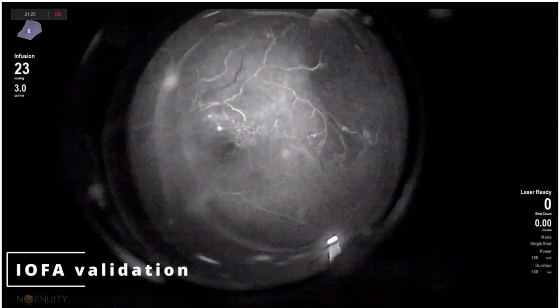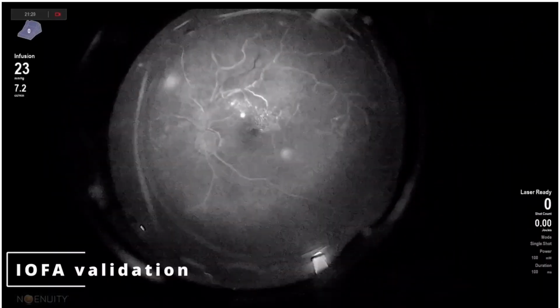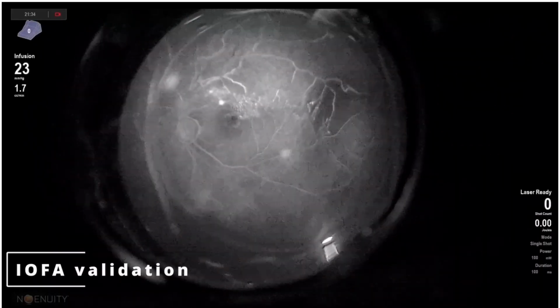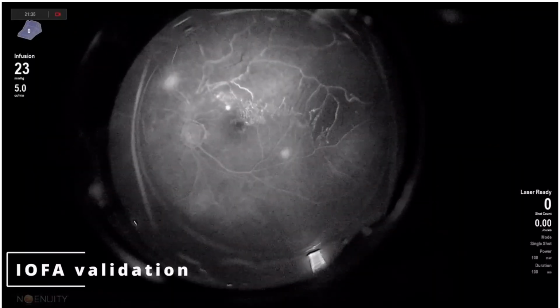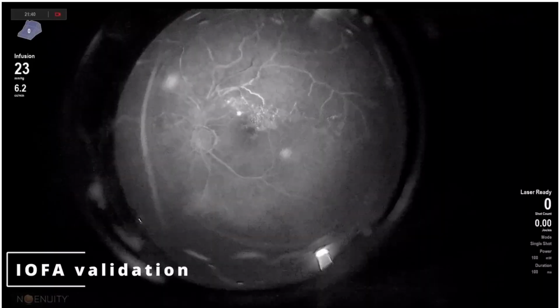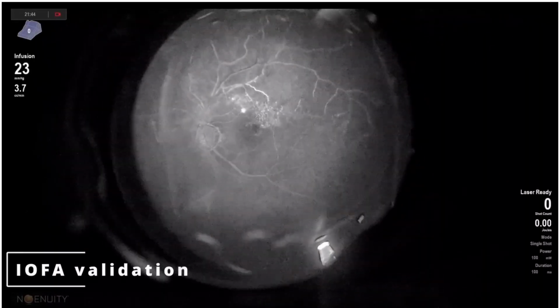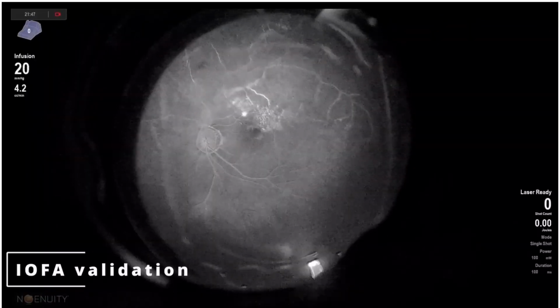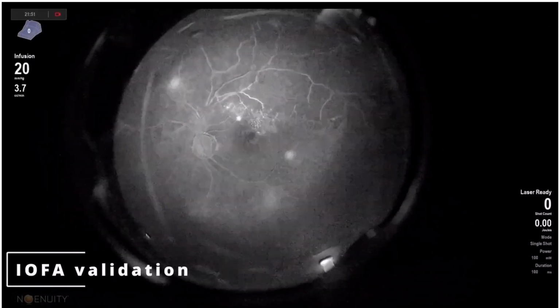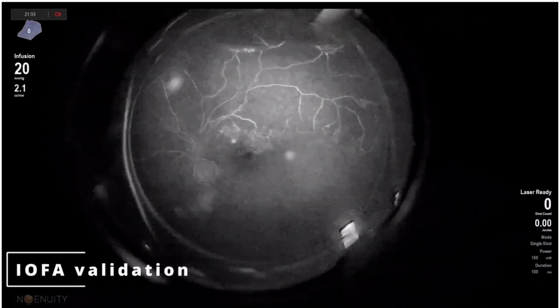Otherwise, in other vascular cases, for example diabetic cases, I must admit that it's not always possible to achieve really nice visualization of the non-perfused areas. So having both imaging modalities, fluorescein angio and blue light reflectance, available in our visualization system might enhance our armamentarium against these diseases.